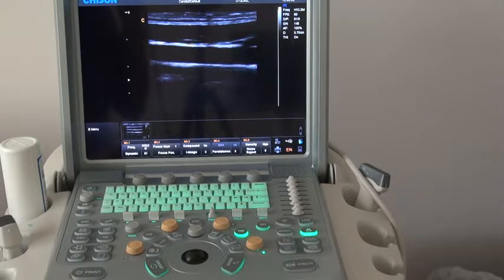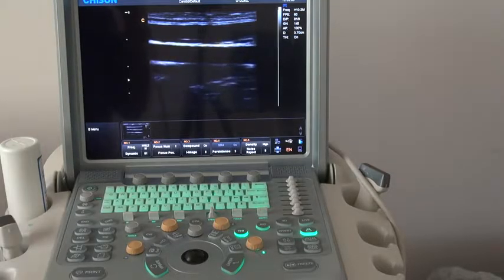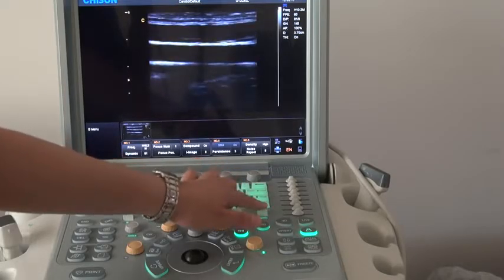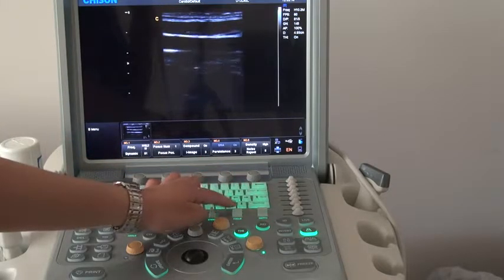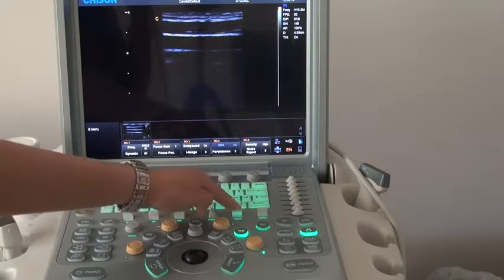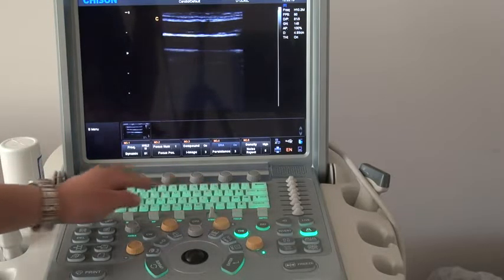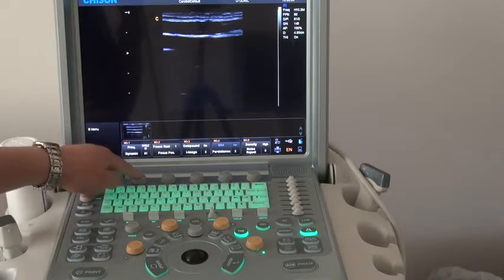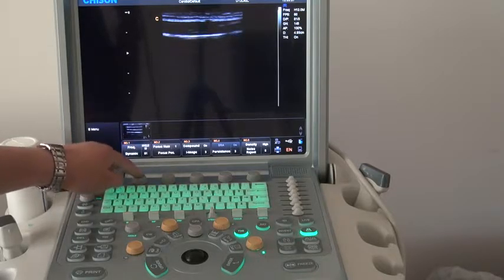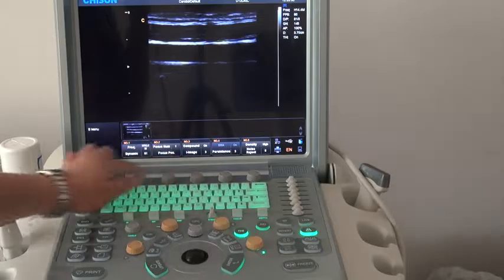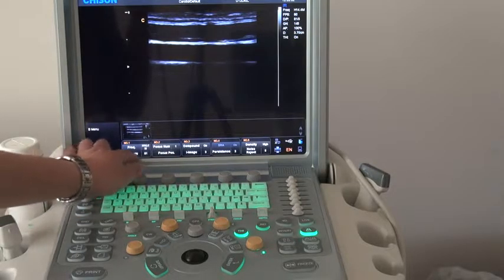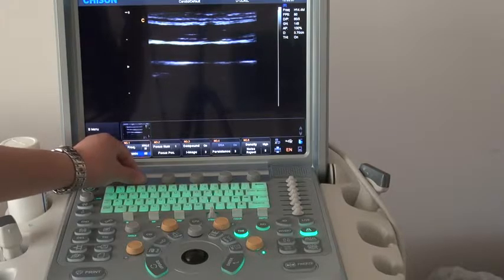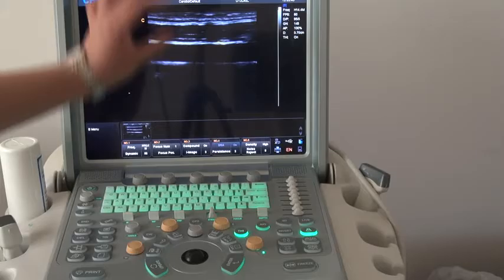In B mode, the parameters that the doctor often adjusts are the depth — you can increase and decrease it — and next is the focus position. Also, here we have two line parameters. In the first line, we can press the knob to adjust it, such as the frequency. In the second line, we can rotate the knob to adjust the dynamic range, to enhance the image's contrast.